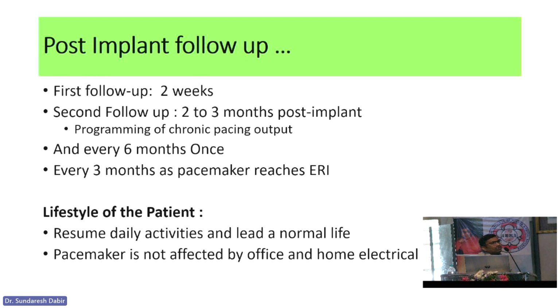Every 6 months should be okay to check the pacemaker. We can call the patient for a regular checkup. But when it is going to near ERI, say the battery lasted 10 years and the 9th year is coming for follow-up, we should not call the patient every 6 months or 1 year. We should call the patients more frequently, every 3 months or 2 months, so that we can understand the battery longevity and decide when to replace the pacemaker.